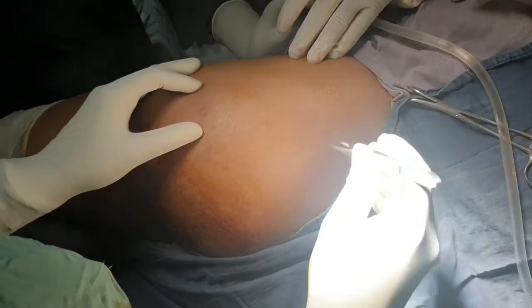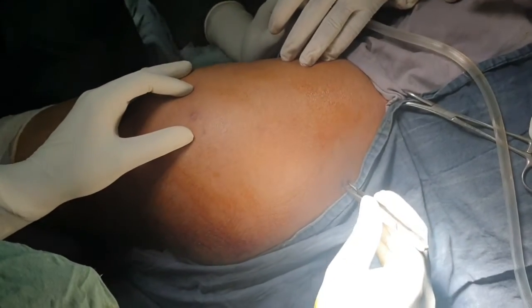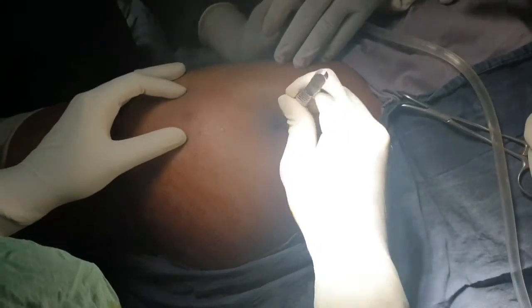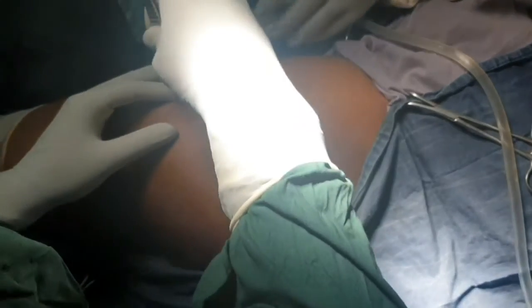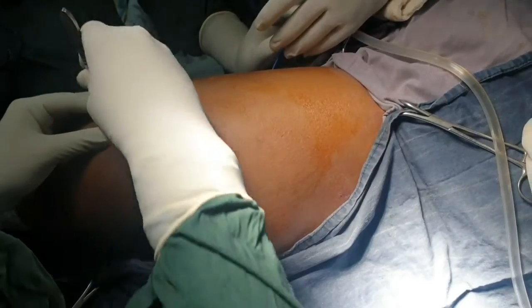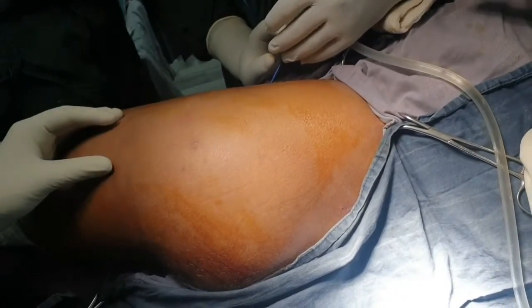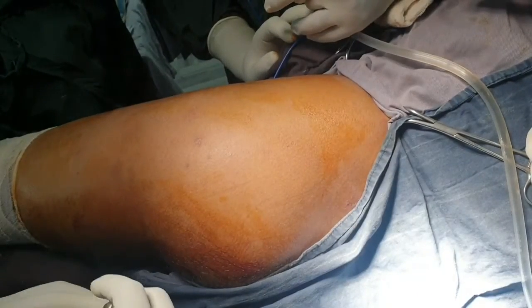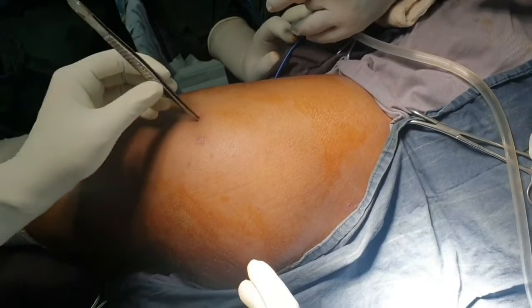So our proximal-most incision should be here, this is our second point, and this is our third point. You can check the exact landmarks fluoroscopically. So we will go further and check fluoroscopically.